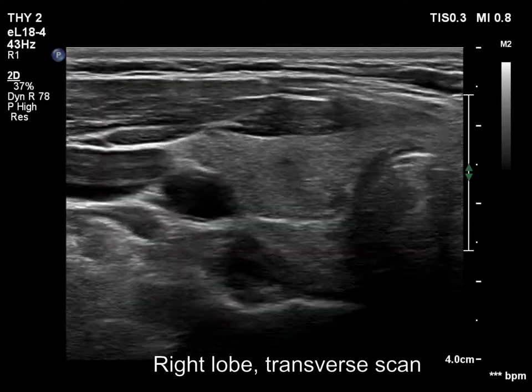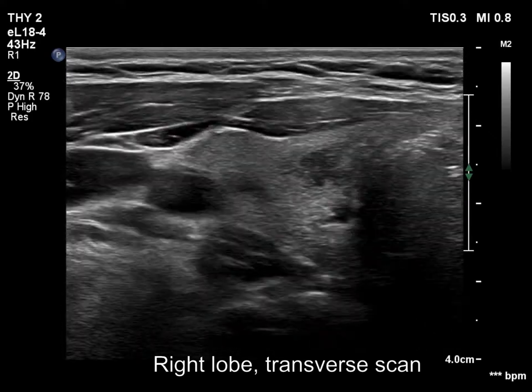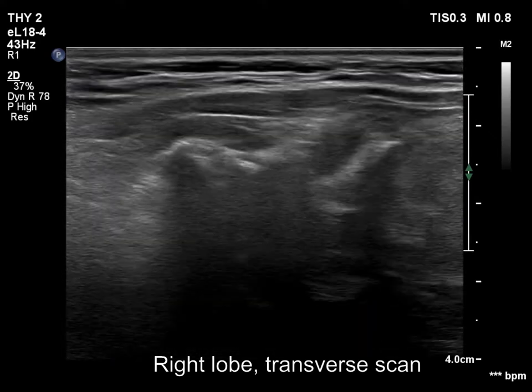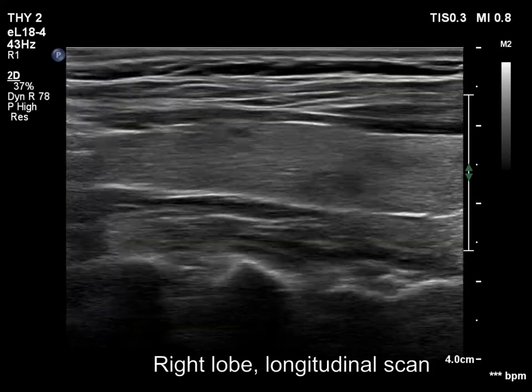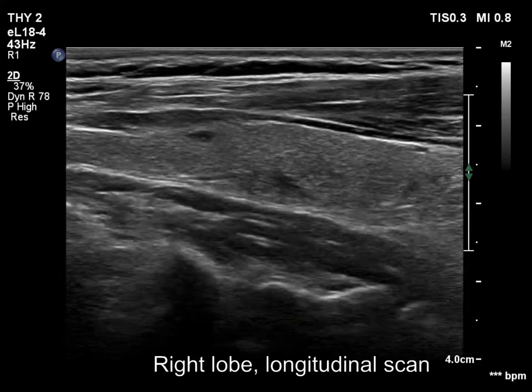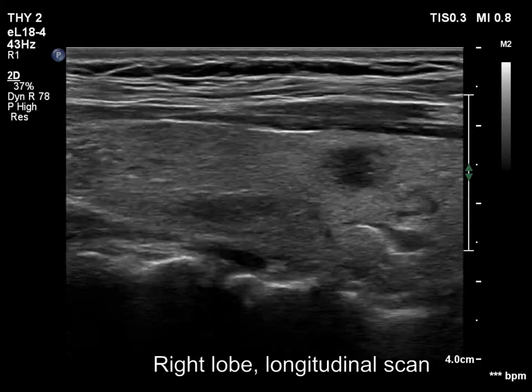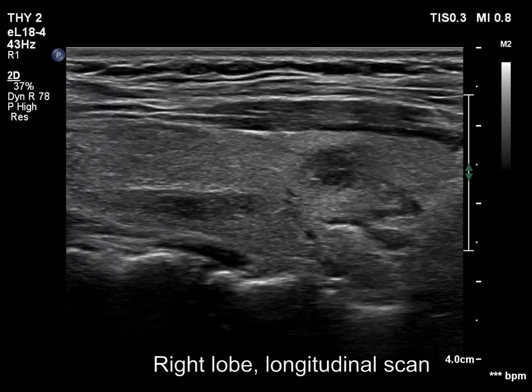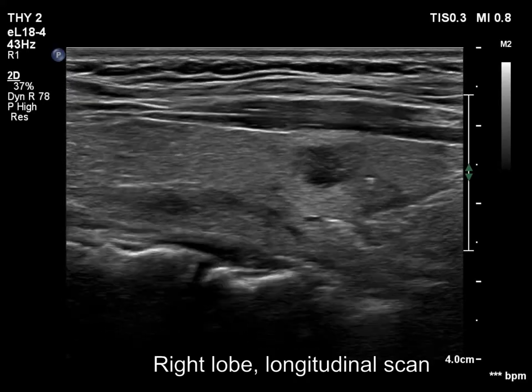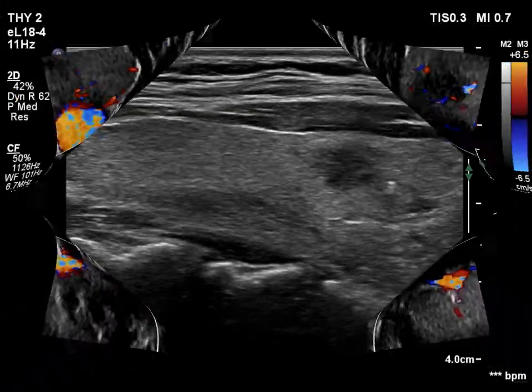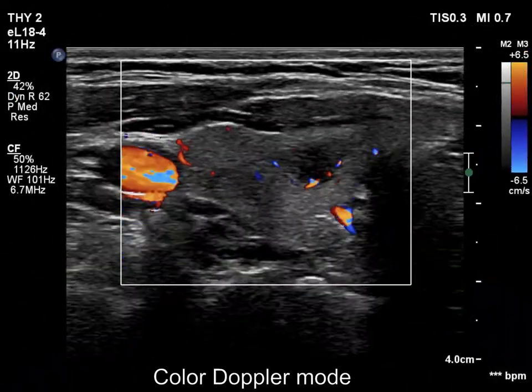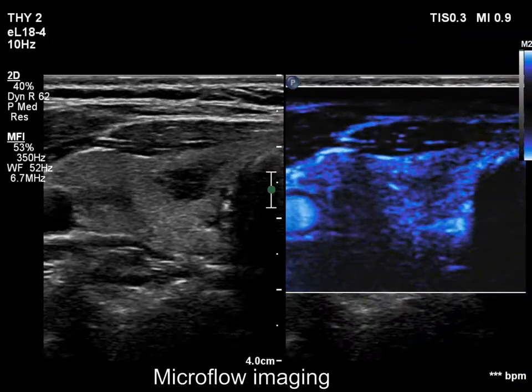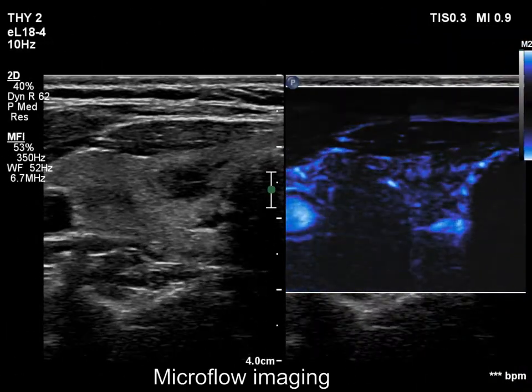The right lobe is echinormal. There are two relatively large hypoechoic areas in the lobe. The borders are irregular, sharp rather than blurred. According to the hypoechoic areas, the vascularity is decreased.